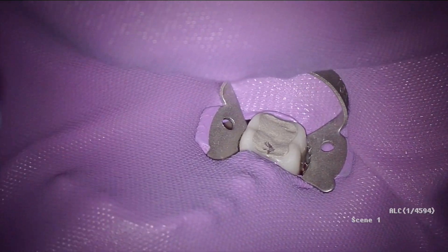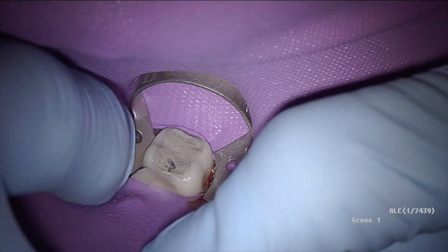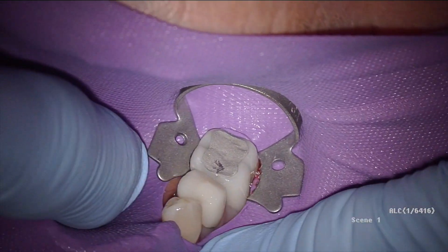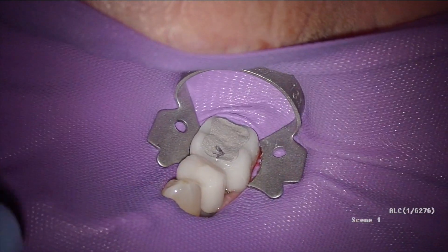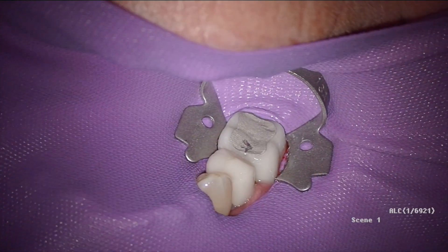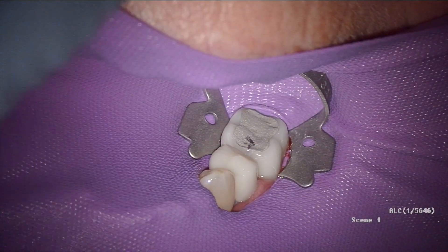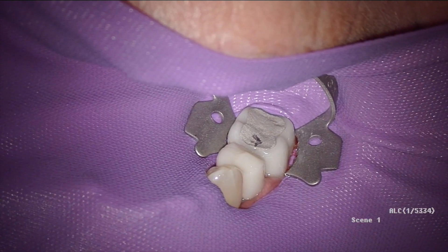And finally here, this is at my buddy Majid, a prosthodontist. This is his Leica camera. If you've made it this far in this video, I congratulate you. If you see in the lower right, it always says scene one. He has a high definition camera through his Leica microscope. I get an HDMI out feed and I load that into my Mac — I record it through QuickTime on my MacBook. So whenever you see that scene one in that ALC one, that's actually a Leica microscope.